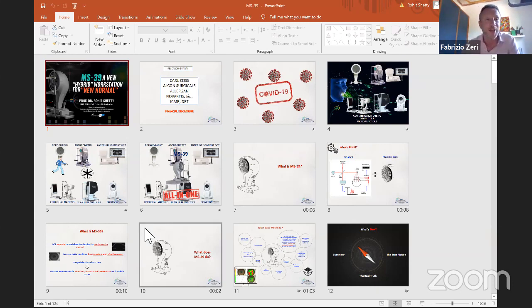Clearly, the answer is you can. You can perform non-invasive breakup time on the contact lens surface, but it provides us very different information. For example, you're not measuring the tear film, but the pre-lens tear film. That is completely different. For example, there is no mucin layer on the pre-lens tear film.